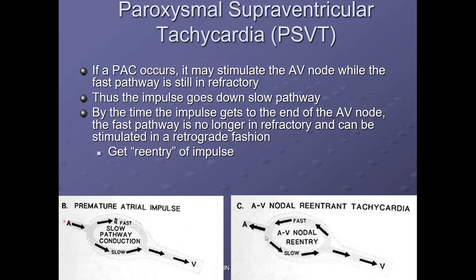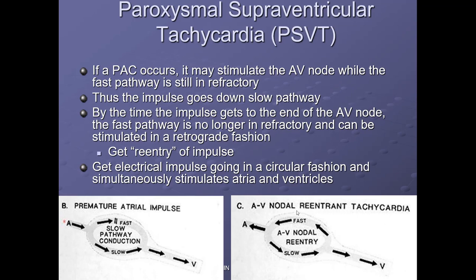And so you're going to have a really high atrial rate, really high ventricular rate, and the atria are actually being depolarized in the opposite direction. Normally we get the atrial depolarization coming back this way towards the ventricles, but in this case, due to this re-entry, they're actually being depolarized in the opposite direction. So you could guess what that's going to make the P wave look like. The P wave is going to be upside down, because normally we get an upright P wave because electricity is flowing down and across the atria, and in this case, the electricity would be flowing up, back towards the SA node.